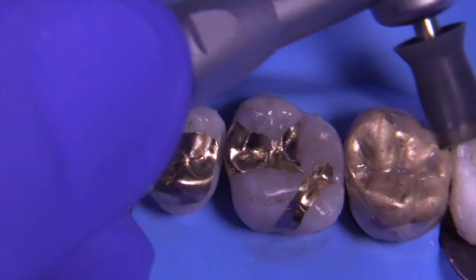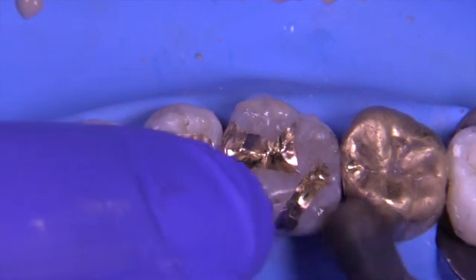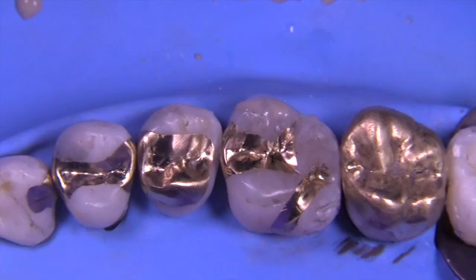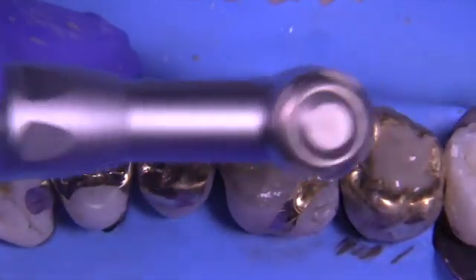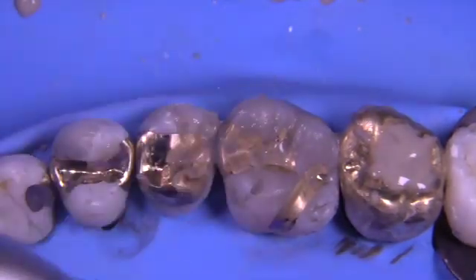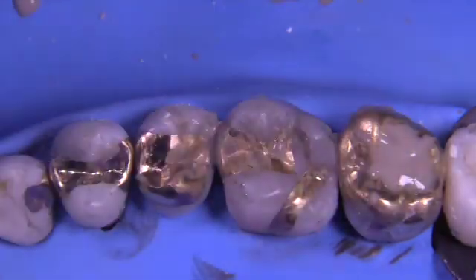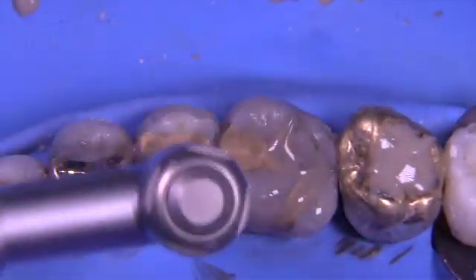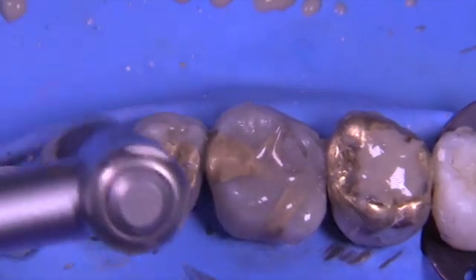Try to rotate the cup from gold to tooth just like we were doing with the disc as much as possible, changing direction when needed — always thinking about forward/reverse with slow speed. This is a slurry of water and pumice; some people use alcohol and pumice, but I prefer water. We're not going to spend too much time on the castings at this step because it's possible to over-polish — this is relatively abrasive compared to subsequent steps. About five seconds per tooth would probably be the most I'd use.